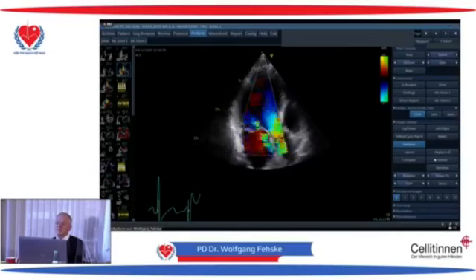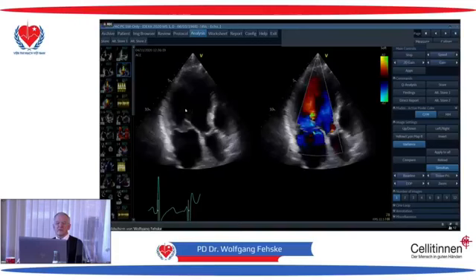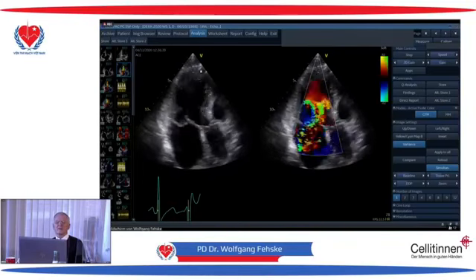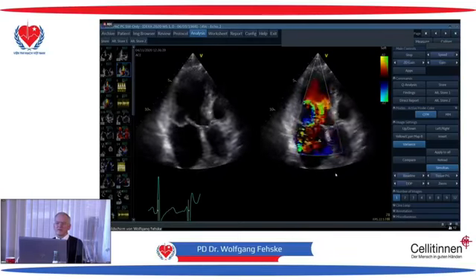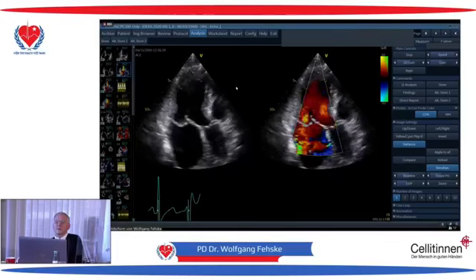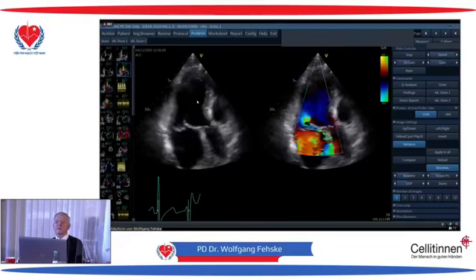echocardiography. Means that this patient has a severe mitral regurgitation, and we know that there's a pseudo-Barlow and there is some prolapse, there's no flail leaflet, but there is an absolute arrhythmia, no, sinus rhythm. But I would really say that this patient has a primary mitral regurgitation.